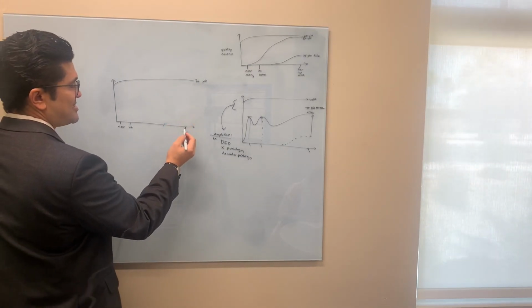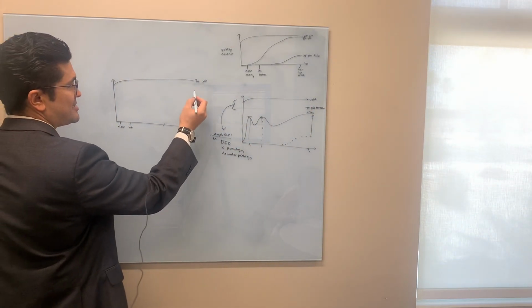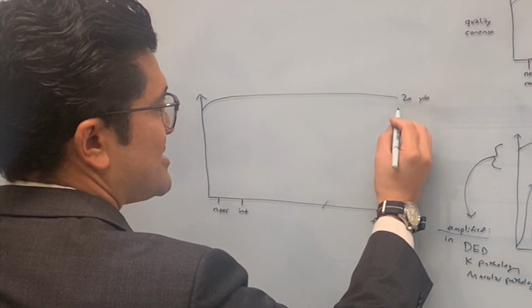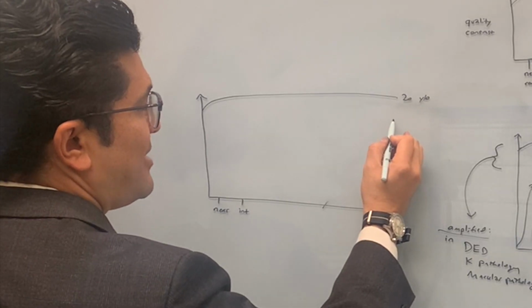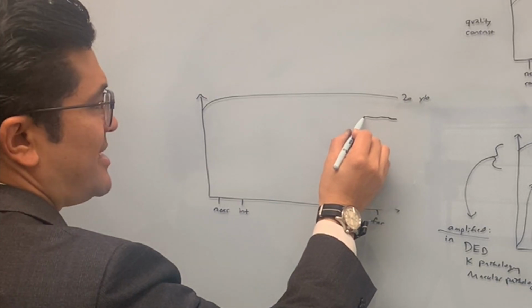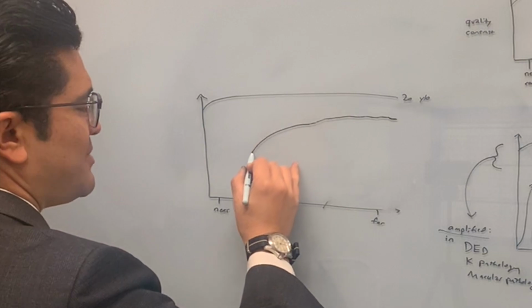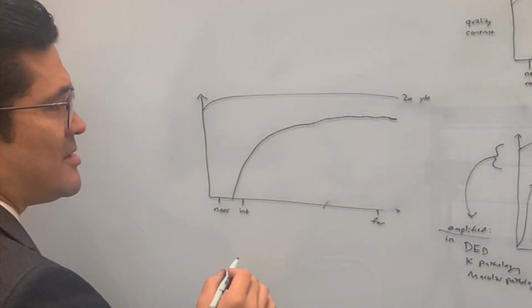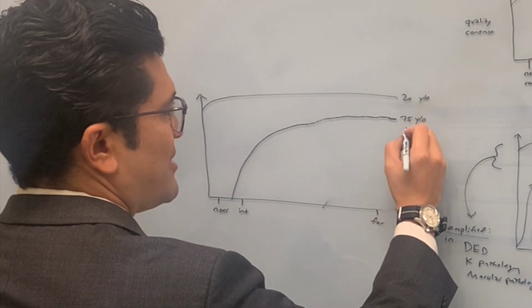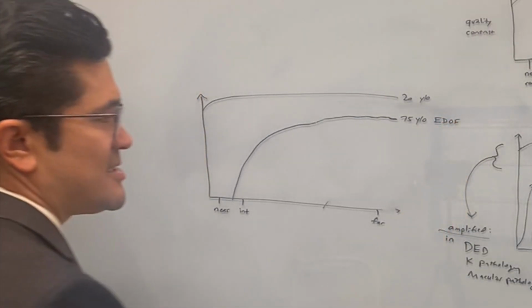One more person, and this is the same 75-year-old, but let's say we didn't do a multifocal. Let's say we did an extended range lens, classically like Symphony or like Vivity lenses. So let's draw that. It's going to be about the same, maybe a little higher peak, and then it stays up pretty high because it stretches that focus. Intermediate's good, but near drops off. So the defocus curve is slightly different for the 75-year-old with a Vivity lens or an extended depth of field lens, slightly different.